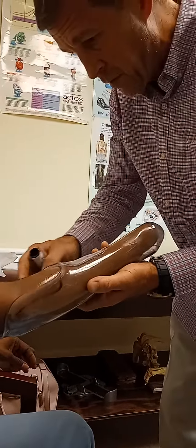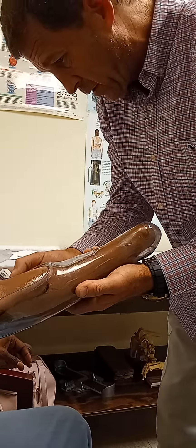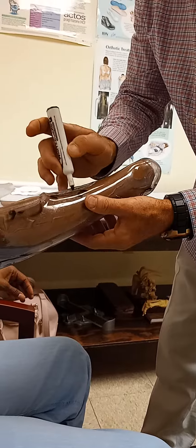Minus eight to ten millimeters. This is snugger in through here. I'm still going to take this in a little bit tighter here, about eight millimeters. Same thing here, I'm going to take that in snugger too. I'm taking this up as I marked, two inches higher. Better down here, right? Yes, sir. More comfortable.